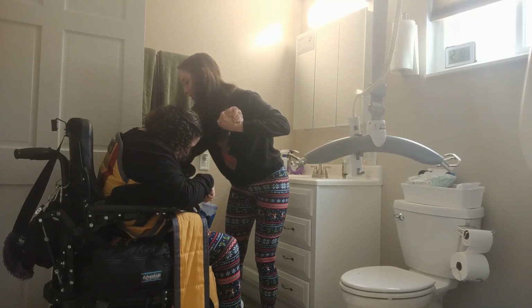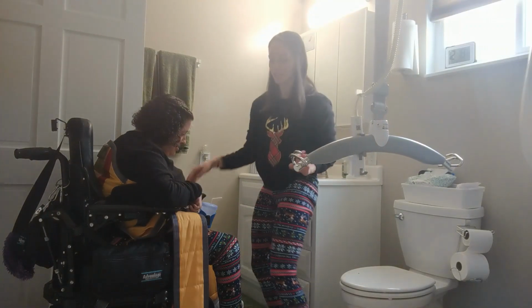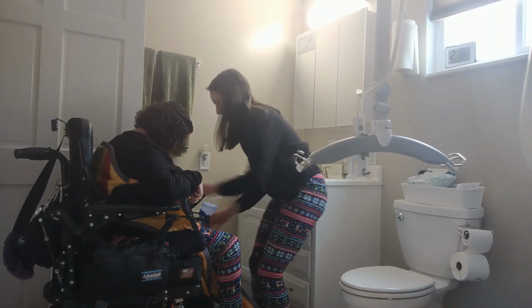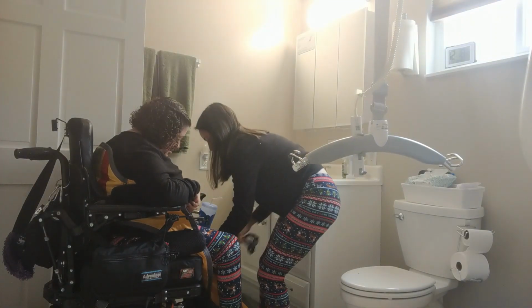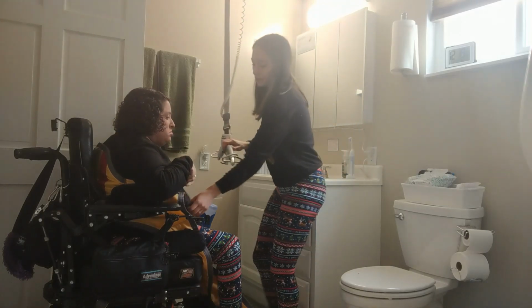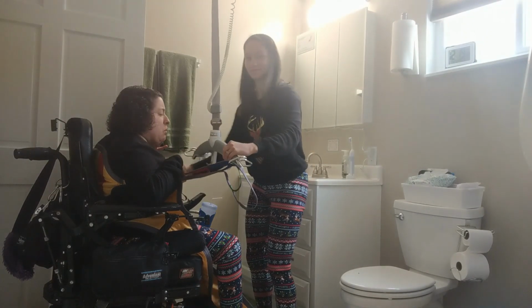And we slide in and slide out. You're going to take the black straps and Velcro them together so that she's nice and secure. And then we work the straps under the legs, like so. Okay. And you're going to hook them onto the lift. There's 4 different levels, but we usually do it on the blue. Right, because that helps me stay at a 90-degree angle, which is what we want orthopedically.